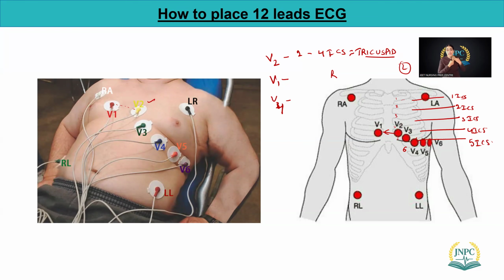So always know how to check that. If you really palpate this area, you feel your clavicle bone. That's not your rib. But right beside that, if you really press that area, you will see the first rib. So first and second, if you press that area, if you're not obese, you can feel that, and then you will figure out that is your first intercostal space. This is just basic, how we check those anatomical landmarks. So V4 should be in your fifth intercostal space.